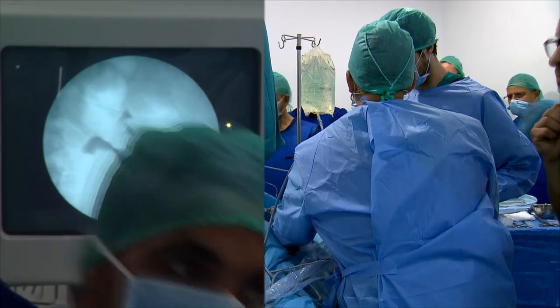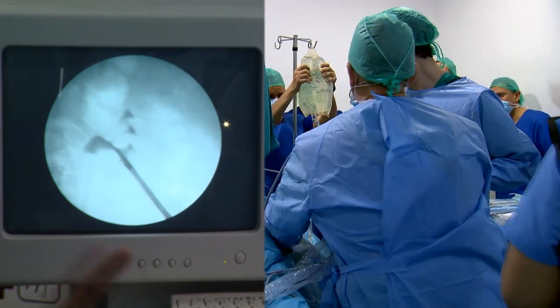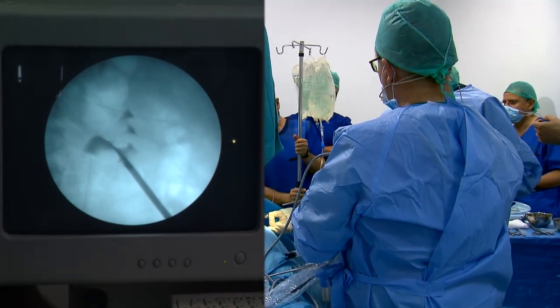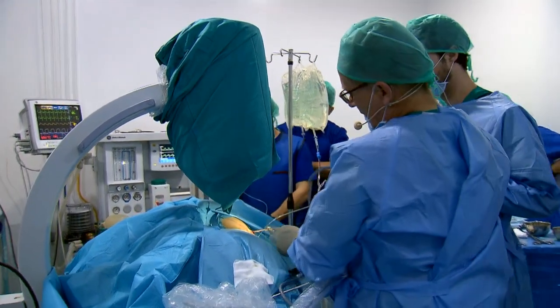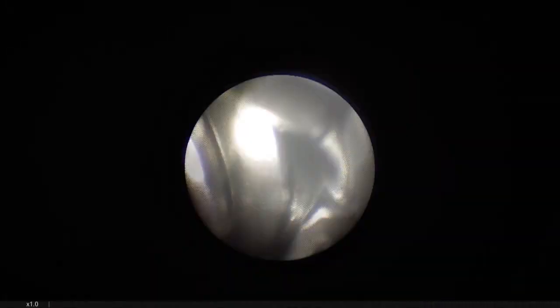Water is okay. You can put it higher, please. Higher. Oh, leave it, it's okay. We will try it. Now we do the mini nephroscopy. The guide wire is in place. This is only the initial phase of the nephroscopy. And now we can switch to the endoscopic view. Yes, we are seeing the endoscopic view.